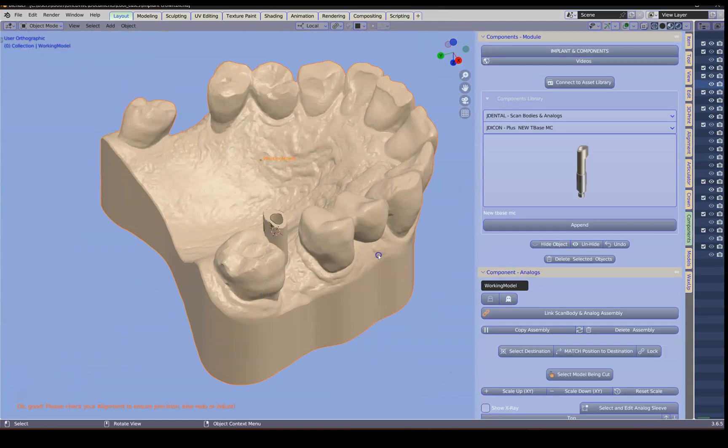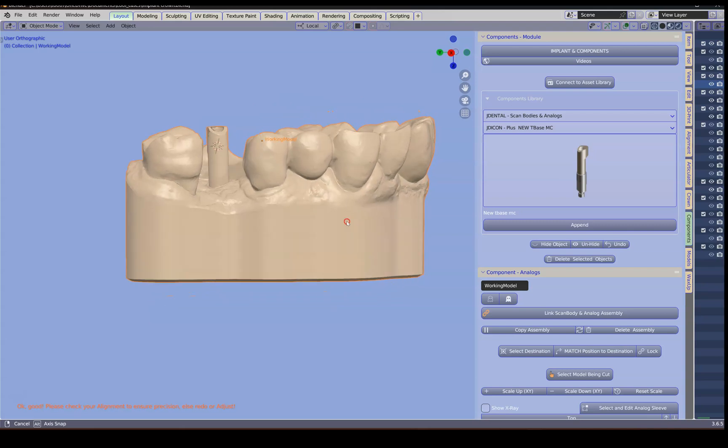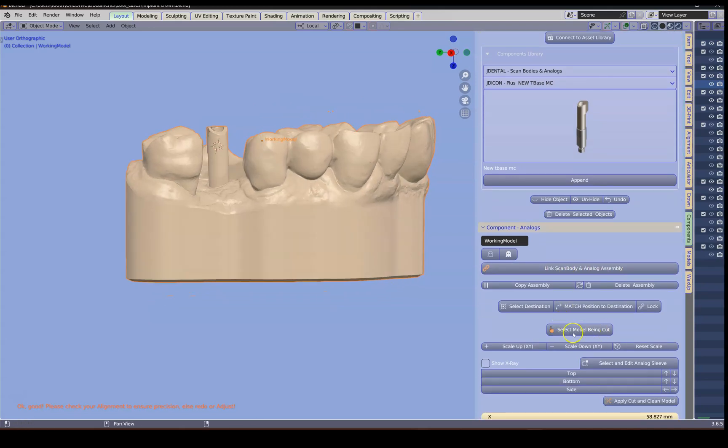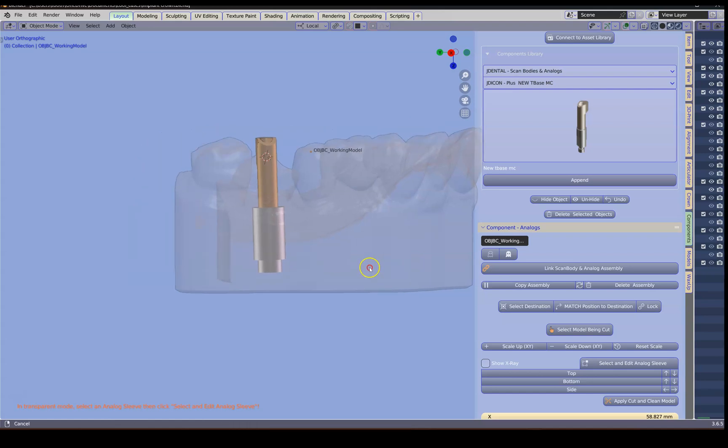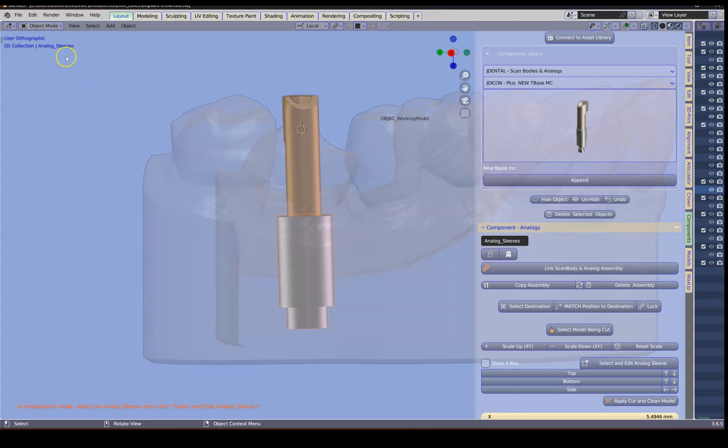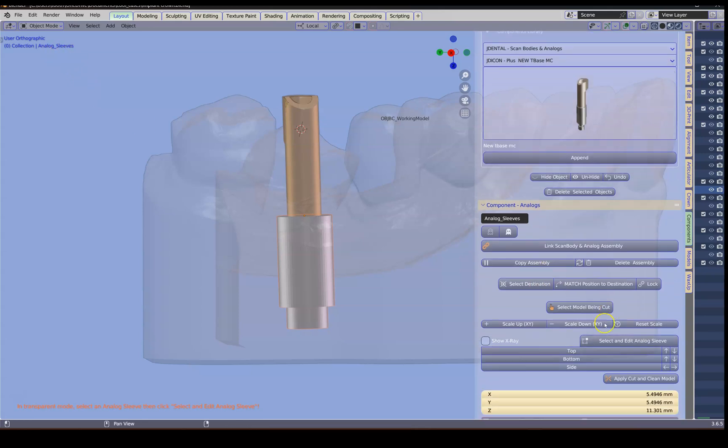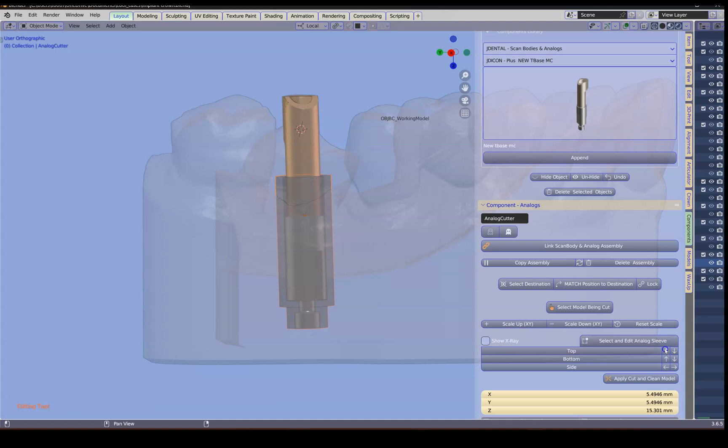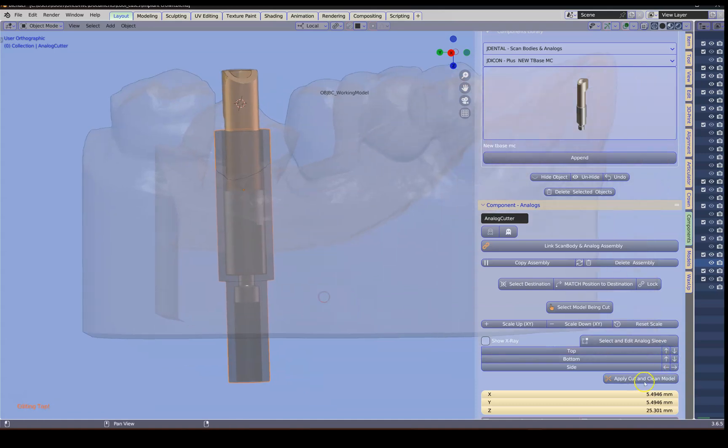Then back to the components module. Select it. And then select your model being cut. This puts it into transparent mode. I'm going to select the analog sleeve. It's called analog lower score sleeve. We're going to select it and we're going to bring that cutter up and the cutter down. And then we're going to cut the model. And this will finish the implant analog model.